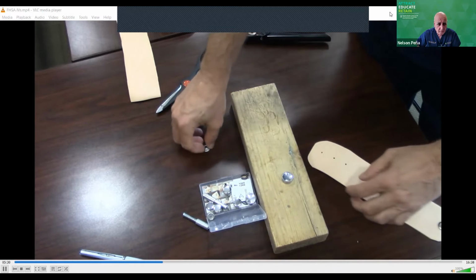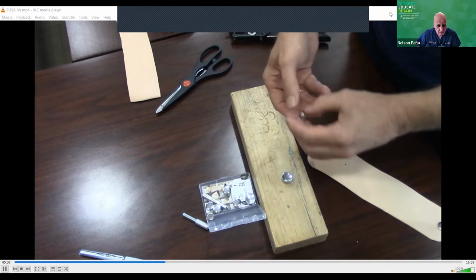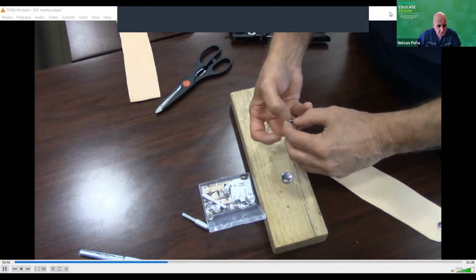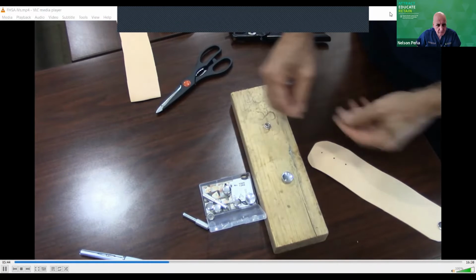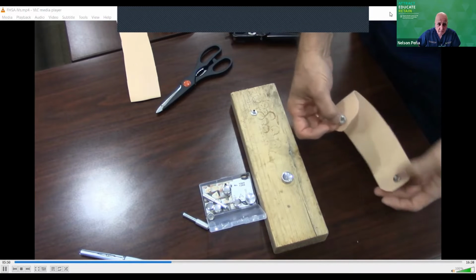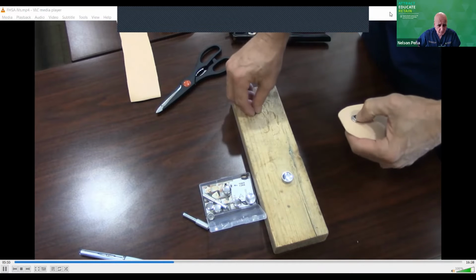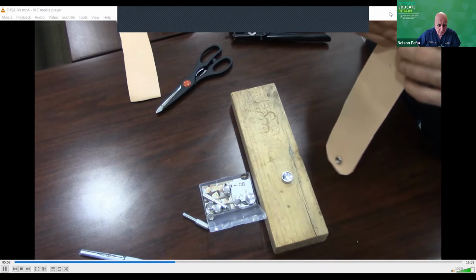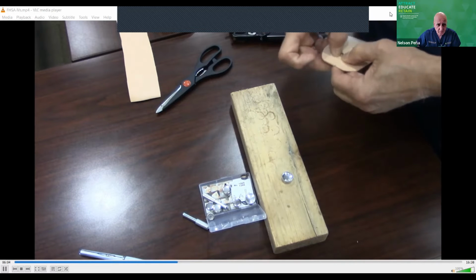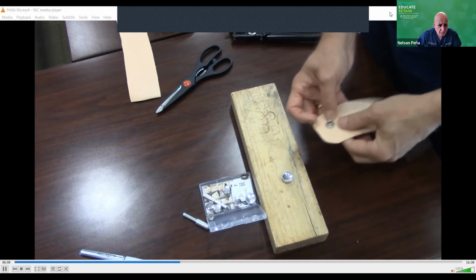Now what I've got to do is put in the other side of the snap. So again, I take the other part of the little snap tool parts. If I can get it apart. Now this obviously has to be fastened to the bottom of this strap here. So I want to make sure when I put it in there that I get the right side. And trust me, I've done this enough times wrong to know it's real easy to get backwards. So double check yourself. Put the inside of this through the pinhole, and then the snap part on top. Double check yourself. You've got to make sure you have it on the right part.